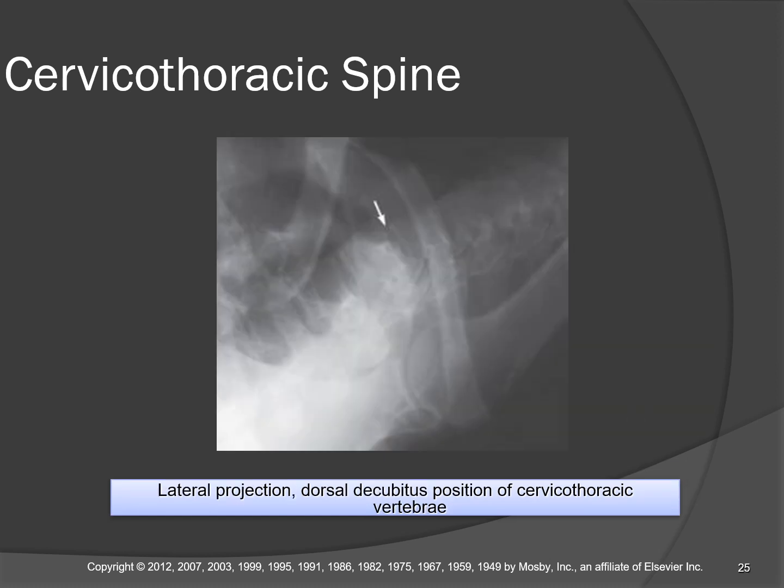So for our cervical thoracic swimmers, the anterior edge of the vertebral bodies, that's the bare minimum for what we need. We would like to see open intervertebral disc spaces. So remember that tube angle? I said angle about 2 to 3 degrees. If you do more than that, you're going to start closing the disc spaces off, and then they're going to look like they're pathologic and collapsed. So be careful with that.